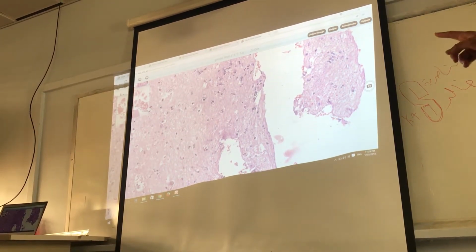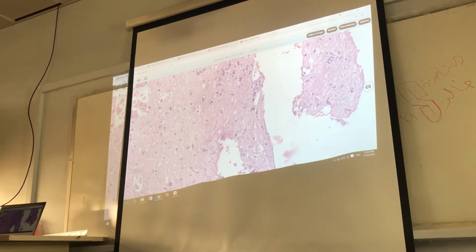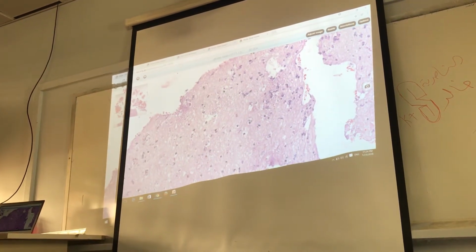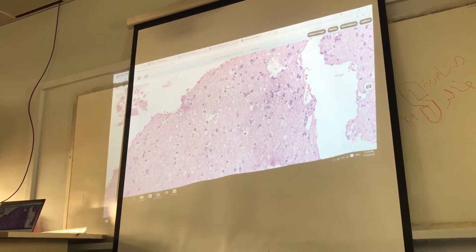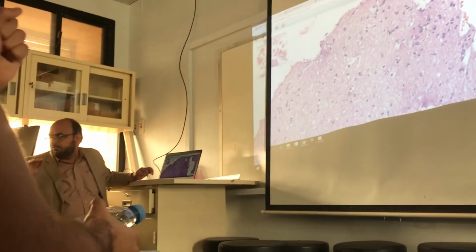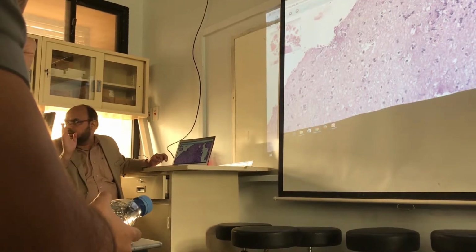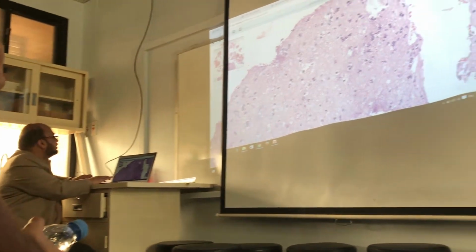And this is an oligodendrocyte that has a halo. Yes, the one having a halo is the oligodendrocyte. It's not clear for microglia, because normally you don't see them. If you see them, they will develop an elongated nucleus. The elongation is not clear here. Yes, I agree.